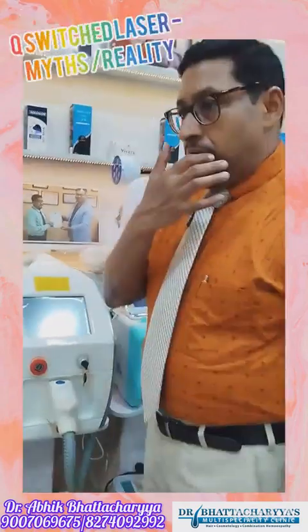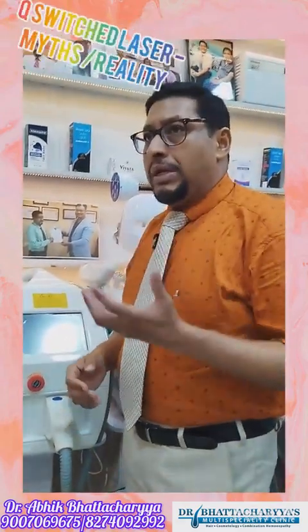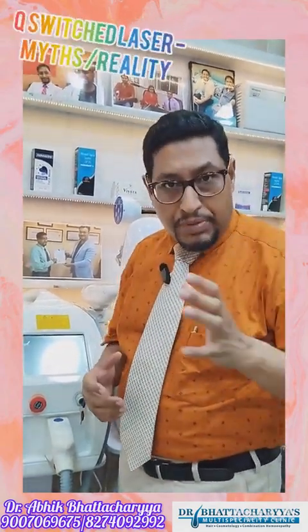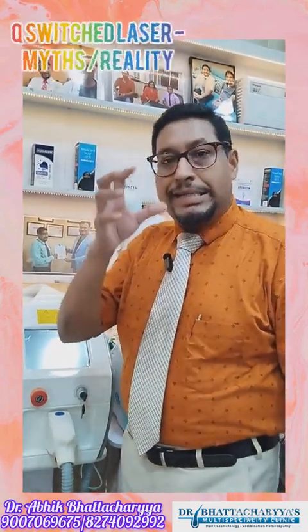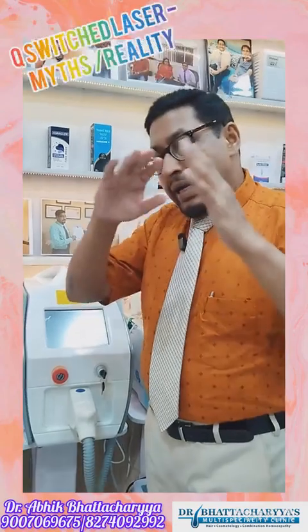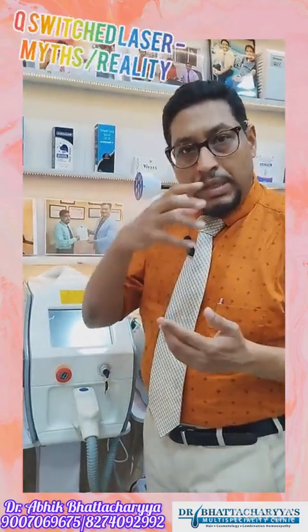When laser light comes, the chromophore catches that laser light. If it is laser hair reduction, that creates heat and burns the hair follicle.